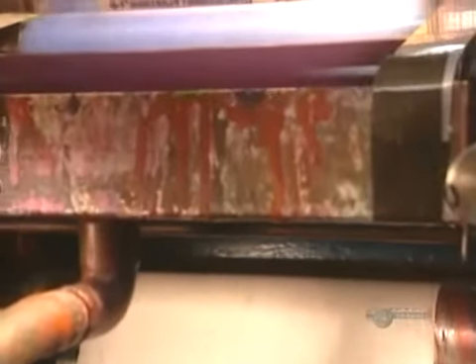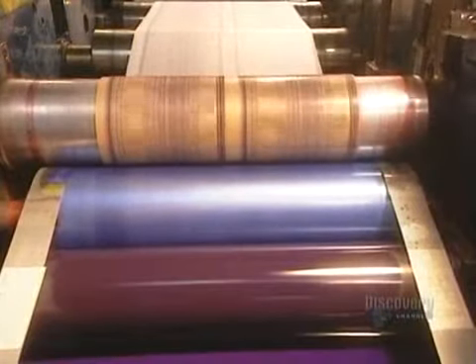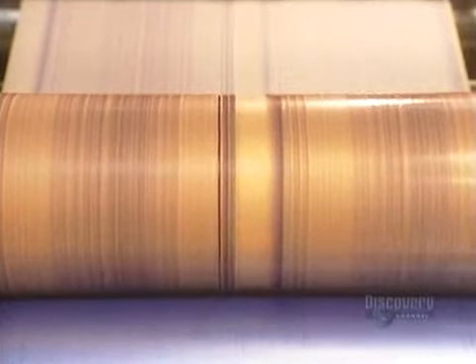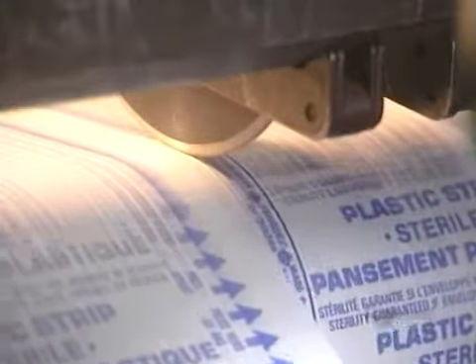Sometimes instructions are printed on bandage wrappers. This paper printing machine is used with bandage machines. Two polymer plates receive ink from a series of rollers in order to reproduce the desired design, and the bandages pass through at high speed.